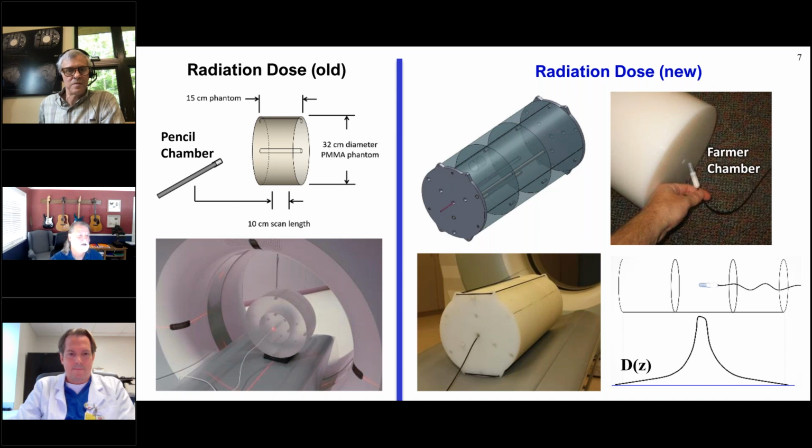So just to dig in, as a board certified medical physicist with some responsibilities here. The state laws that I referred to use this phantom shown in the upper left, and this is the methodology shown pictorially, and I won't go into that, but you can see the phantom in a CT scanner below.